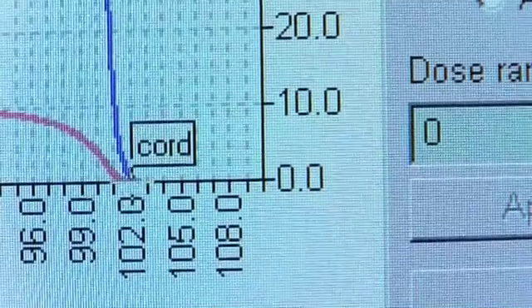And down here, the maximum dose is 102%. So you can confirm that.